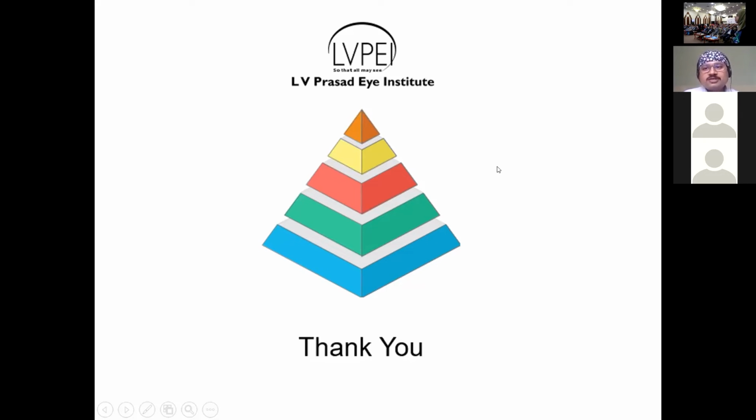Okay. Thank you for the question. It's a very good question. Here we need to understand what we are quantifying. It's correct that OCT will pick up the defect earlier than the visual field. But what we need to understand is what we are quantifying. OCT gives us the quantification of the cells, and it gives a structural correlation, which we calculate from the dying of the ganglion cells or how much tissue is damaged. But still the functional correlation has to be made.